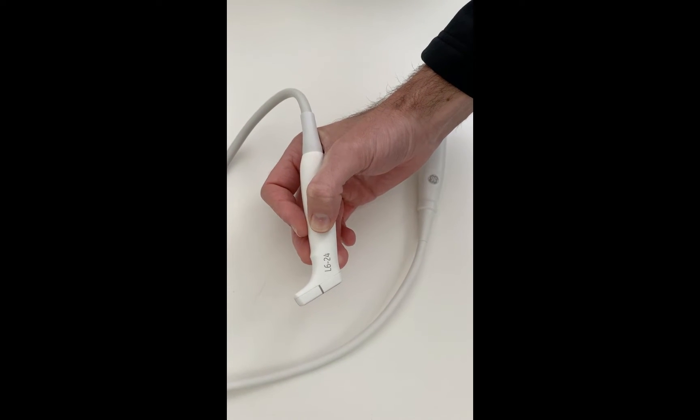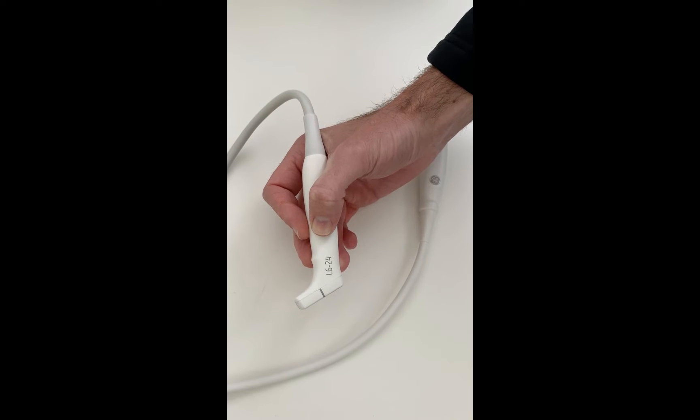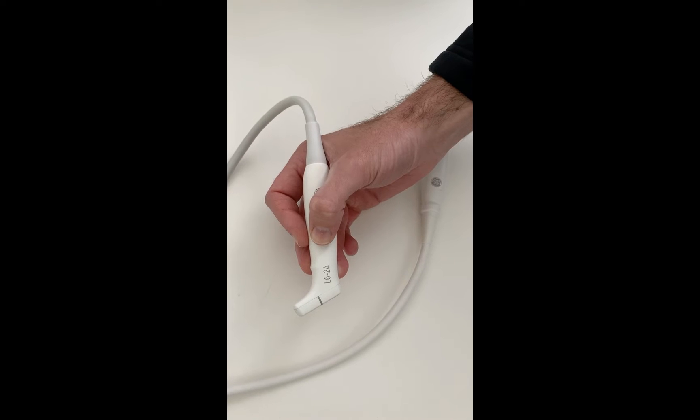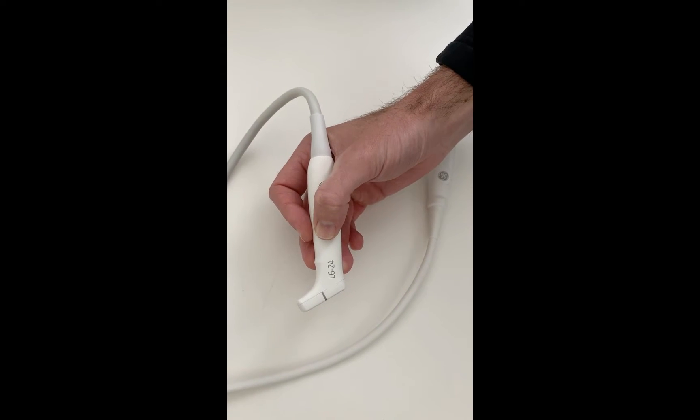We've already known they've had the best hockey stick on the market for a while, but now it's got a bit more punch, a bit more higher frequency — we can do a bit more in the superficial structures, so looking forward to seeing what it can do.